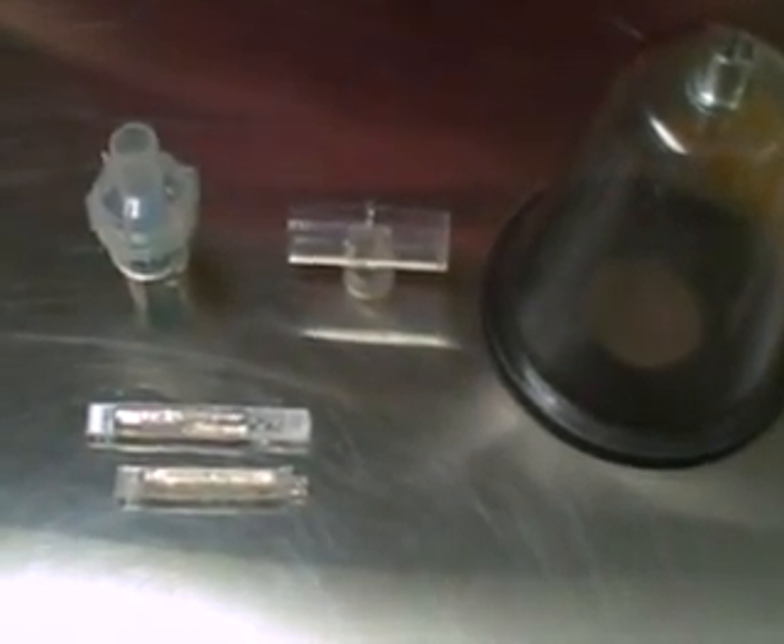On the top left you have the nebulizer, the medicine cup. In the middle you have the T-piece. You have the mask with the diaphragm removed, and you have the medication.